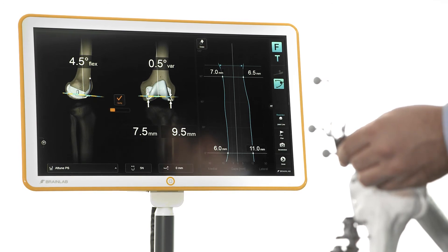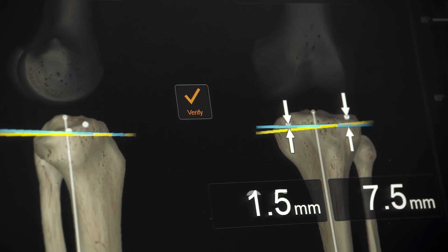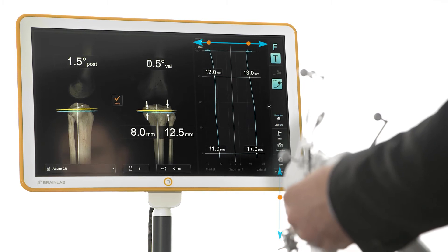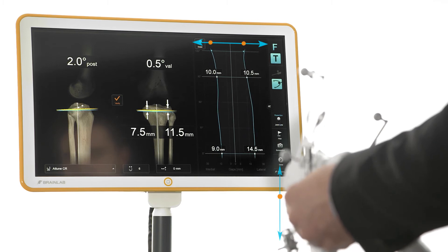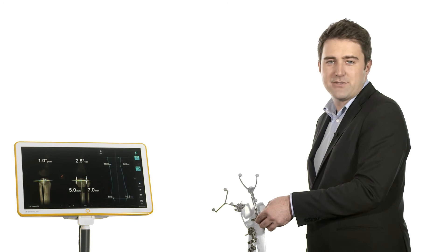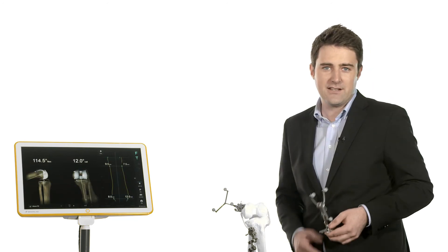After verifying the first resection, the surgeon can decide how to proceed, for example, with the tibial resection. Without any system interaction, the software displays the respective view and the cutting block can be placed. This patient-specific navigation allows the surgeon to foresee the outcome of final joint stability based on the implant geometry and according to previously verified cuts.